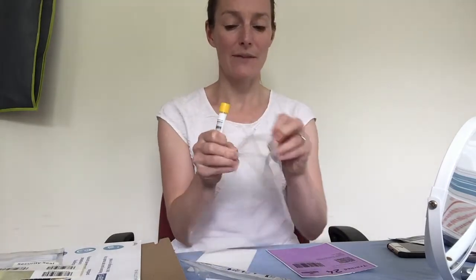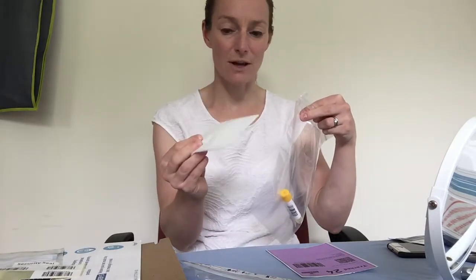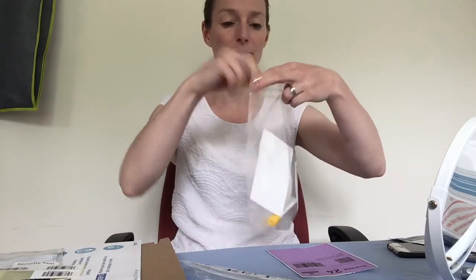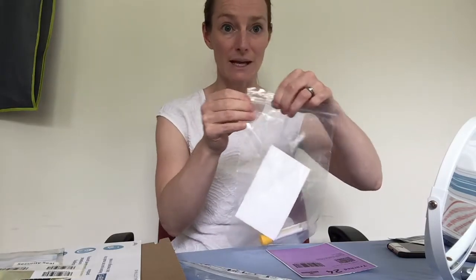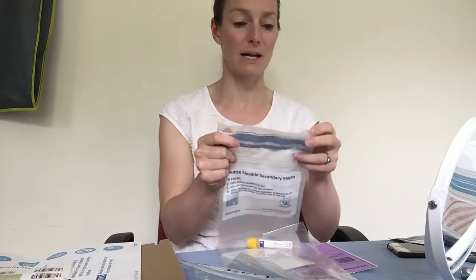The next thing is to put the vial inside the first sealed bag they've given you. Then add the absorbent foam they give you in the bag as well. Once you've done that, seal the bag and then put the bag inside what they call the biohazard bag.